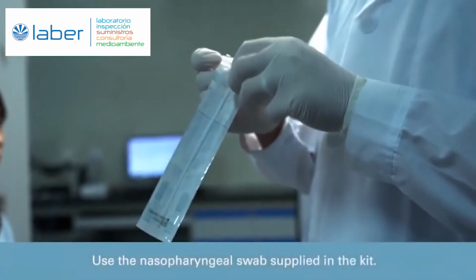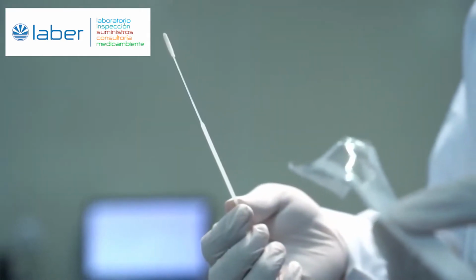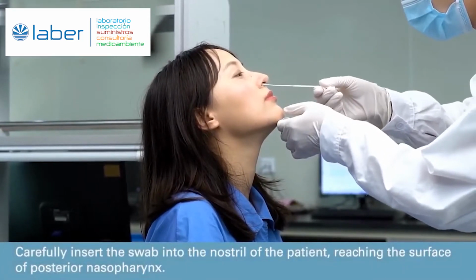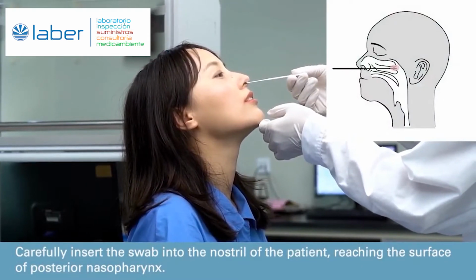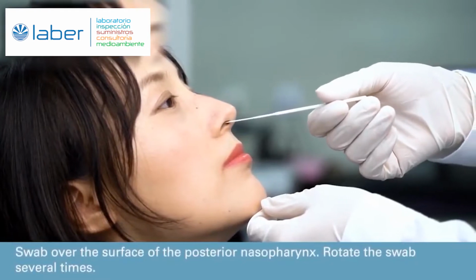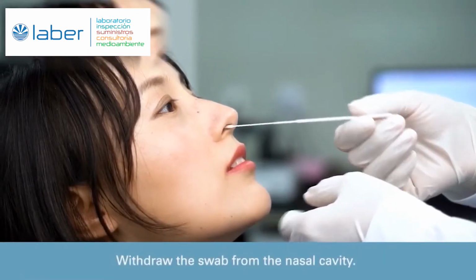Use the nasopharyngeal swab supplied in the kit. Carefully insert the swab into the nostril of the patient, reaching the surface of the posterior nasopharynx. Swab over the surface of the posterior nasopharynx. Rotate the swab several times. Withdraw the swab from the nasal cavity.